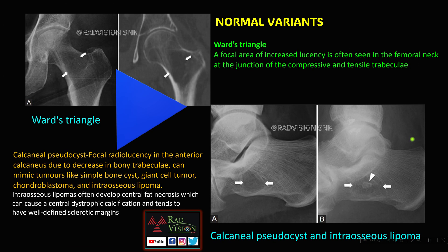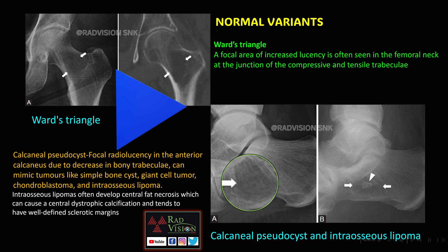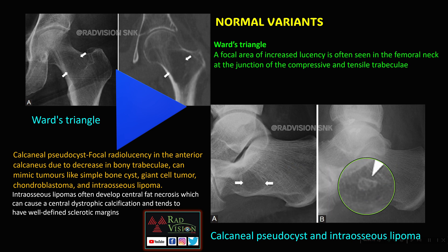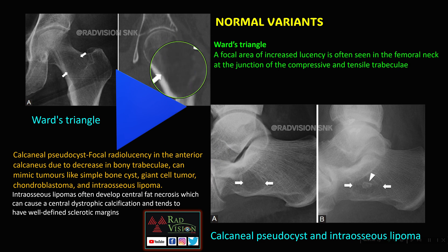Here you can see a triangular lucent area in the femoral neck at the junction of compressive and tensile trabeculae — this is called Ward's triangle. Another lucent area is noted in the calcaneum, also devoid of trabeculae, which can mimic simple bone cyst, GCT, chondroblastoma, or intraosseous lipoma. An intraosseous lipoma can be differentiated from the calcaneal pseudocyst by the presence of a central calcified nidus — central dystrophic calcification due to fat necrosis — called the cockade sign. Ward's triangle and calcaneal pseudocyst should not be confused with GCT, SBC, or chondroblastomas.